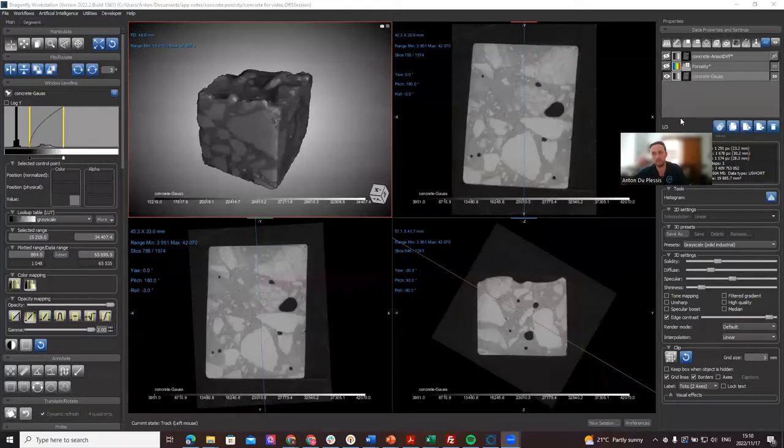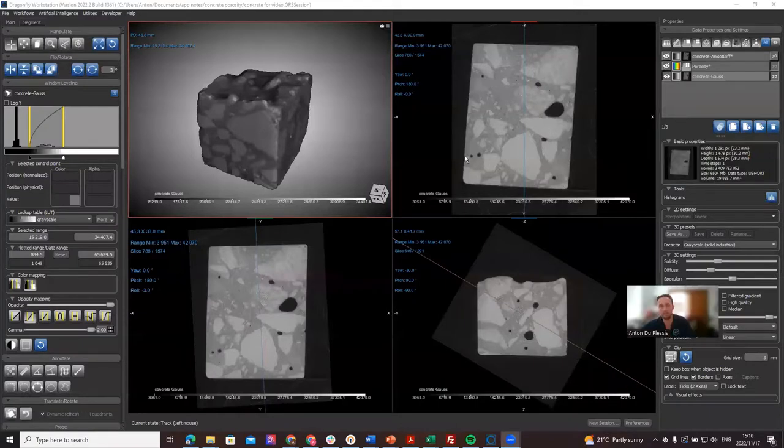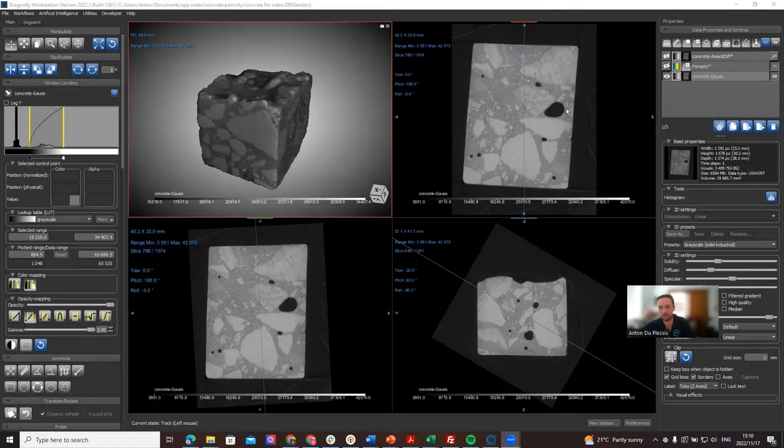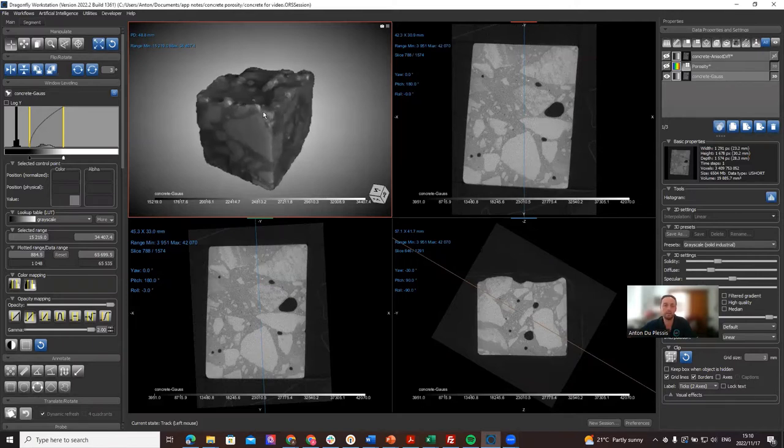Hi there, this is Anton du Plessis and in this video I'm going to show you some new features in Dragonfly version 2022.2. I'll be using a concrete sample which has been micro CT scanned. We've analyzed this before and demonstrated the process to segment the pore spaces and make an analysis of the pore spaces in the previous video, so please check that out. In this video I simply want to show you three new features.